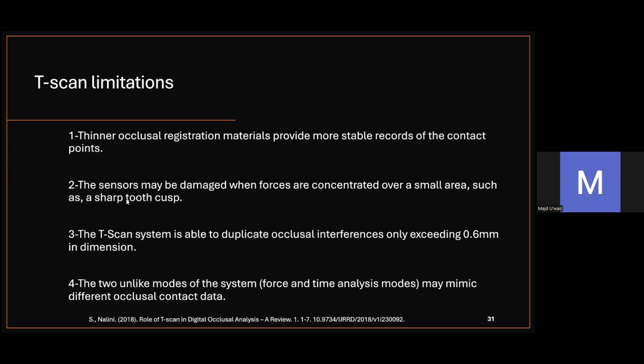Second limitation, the sensors may be damaged when forces are concentrated over a small area, such as sharp tooth cusps, and this may lead to inexact recording of occlusal contact, or may produce artifacts in the produced images.